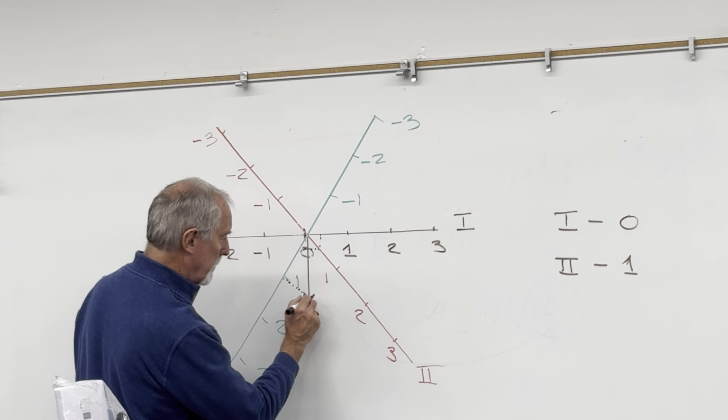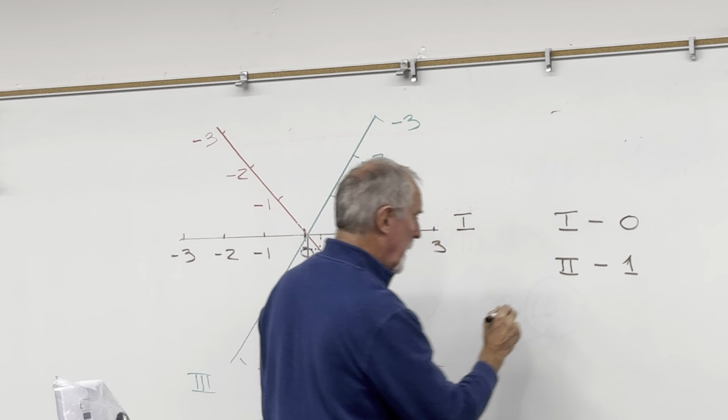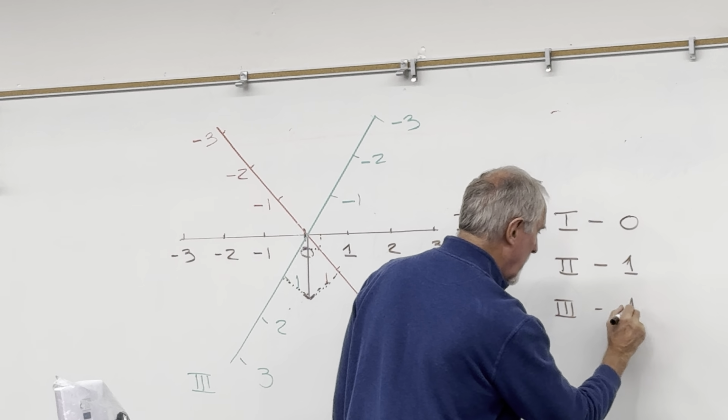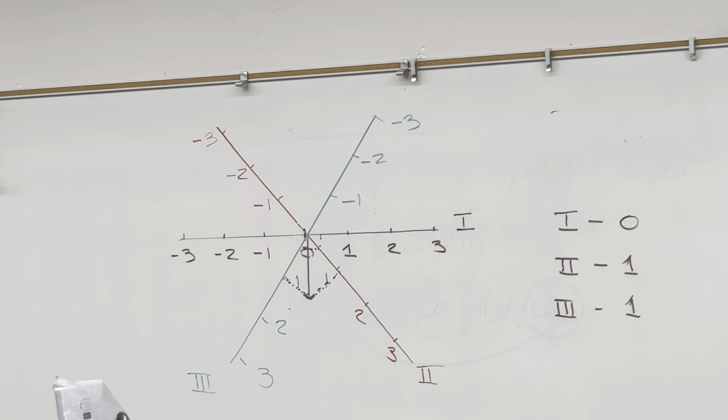And I did that so that in our EKG, if we were looking at lead 1, the amplitude would be neither positive nor negative, it would be 0. And yet, that same electrical activity in both leads 2 and 3 would produce an amplitude of +1. What do you guys think?